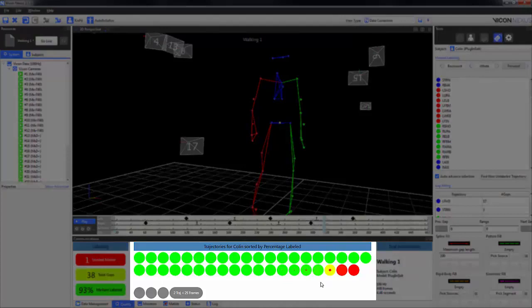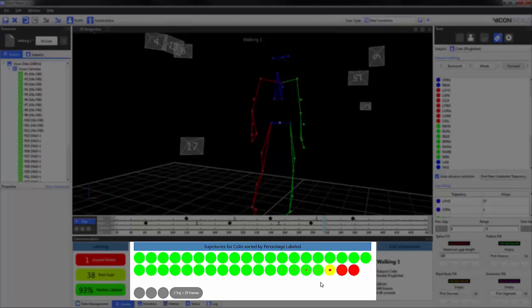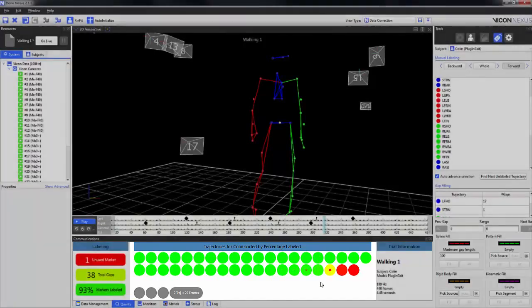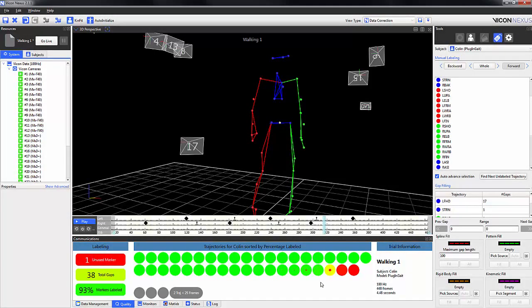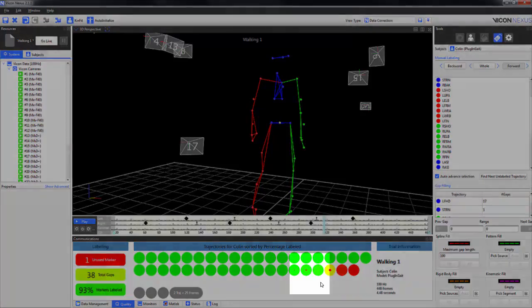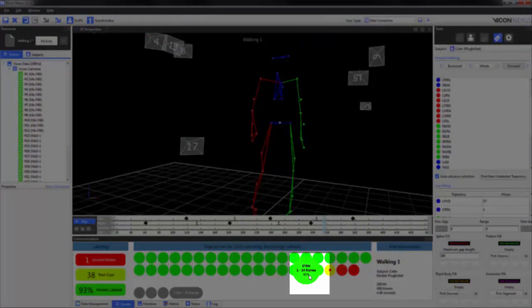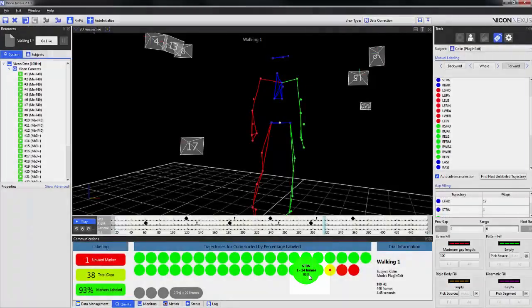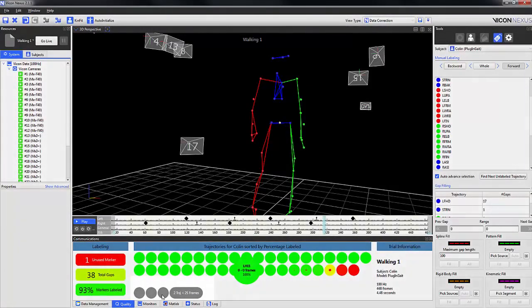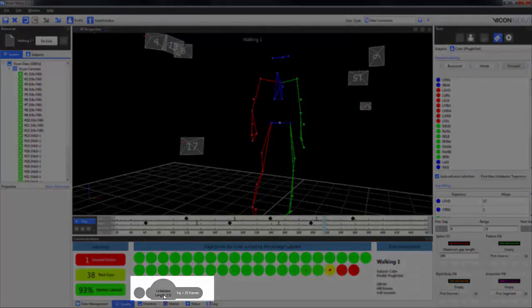Each of these circles represents the trajectory, with the trajectories arranged in the same order as the VST when there are no gaps. If you hover your mouse over the top of the circle, you can see the name of the marker, the frame range, and the percentage of the trajectory that is labeled.